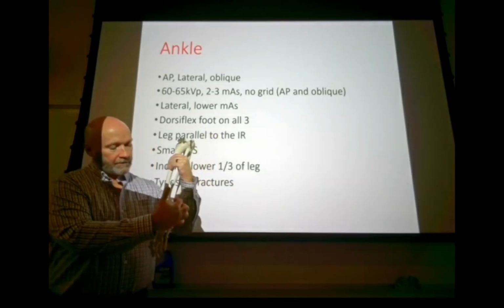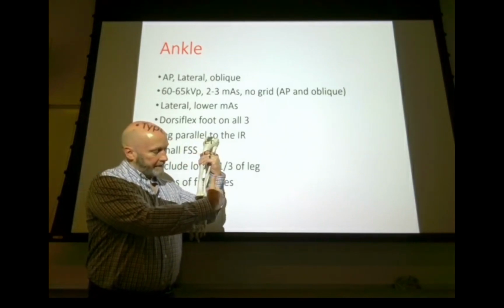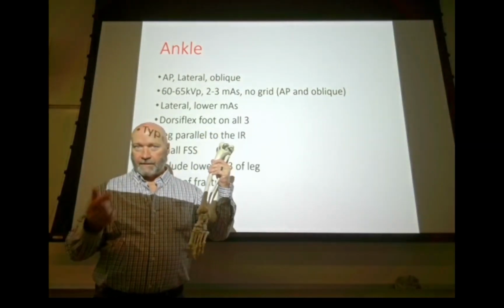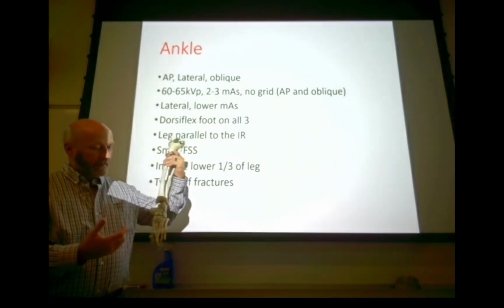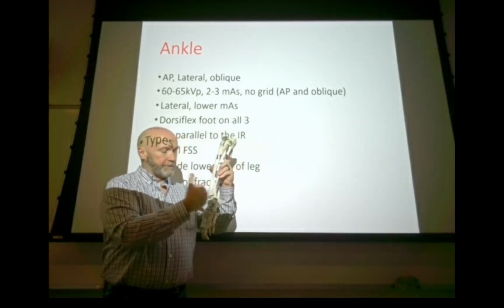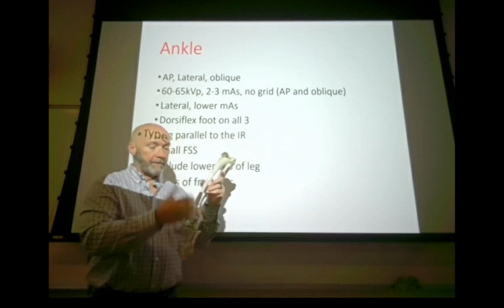But what they'll also do is one or more of the screws that are going into the fibula will go all the way across the cortex of the tibia. That's to reestablish the syndesmosis. Okay, you'll hear them say that we got to put a screw across the syndesmosis. Some of your ankle fractures, you'll see that. You'll have a screw that goes all the way across, and that's because it disrupted that syndesmosis.